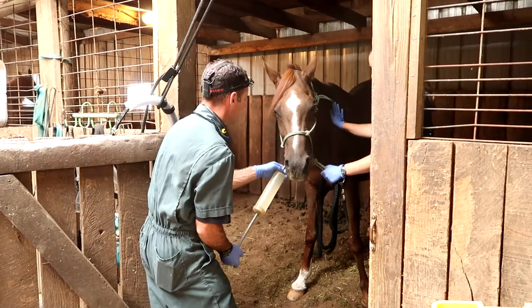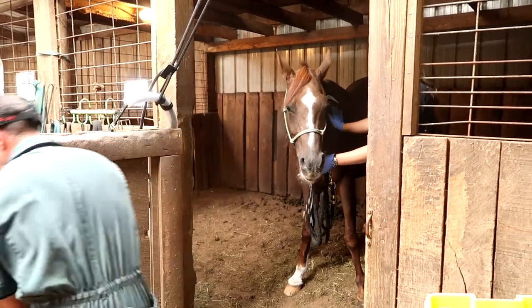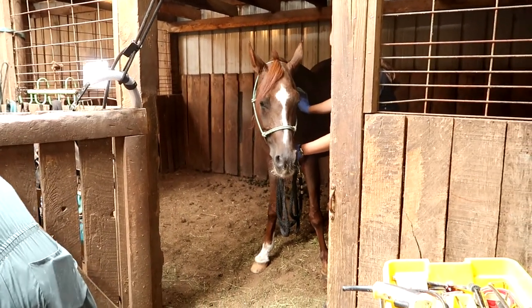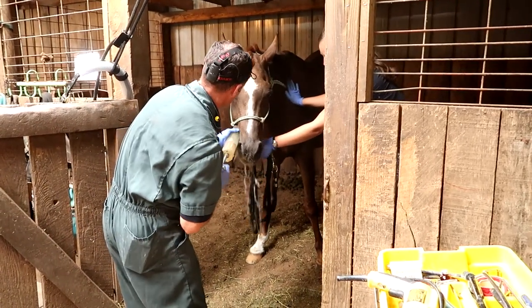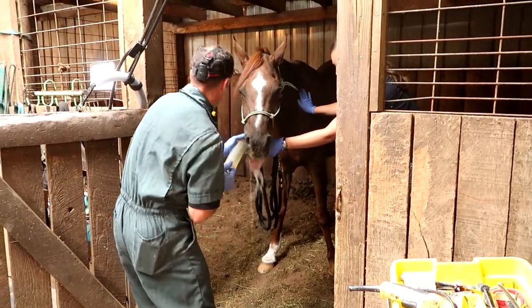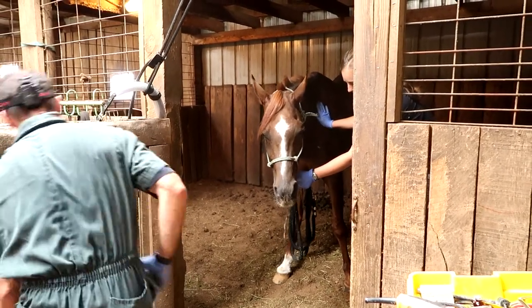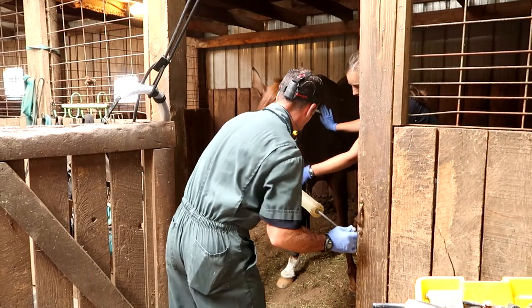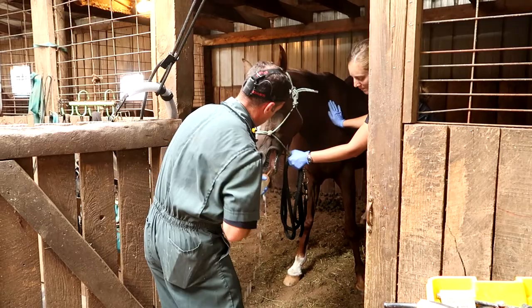In order to keep him safe, I did not video because I was holding on to him and trying to keep him calm while Dr. Scott was giving him the sedative. So he's a little loopy here, and what Dr. Scott is doing is just basically rinsing his mouth out — getting all the extra hay and food and anything that might be stuck in his teeth before he actually starts the procedure.